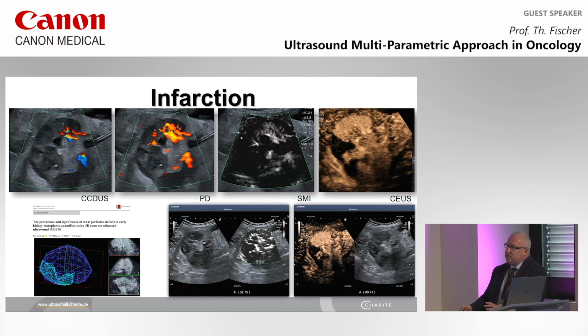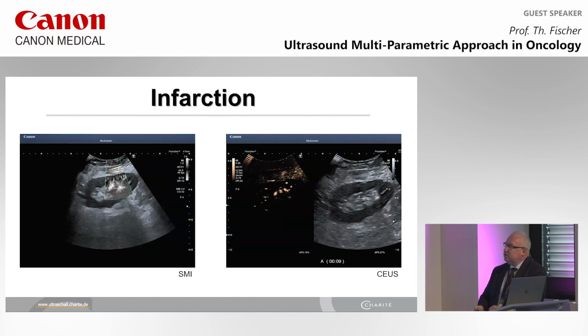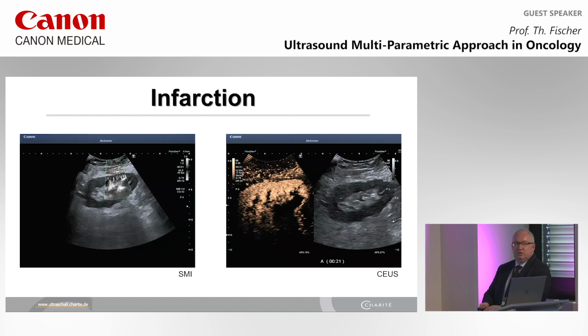And if you reconstruct the volume of this zone, we will understand the outcome for the patient, which is an important tool in my daily business. Another example, infarction zone. Here you can see in deeply located areas, the contrast application is superior. Now we have a clear demarcation of the infarction zone, slightly better than in SMI, so there is a clear value to use contrast application for this very special purpose.